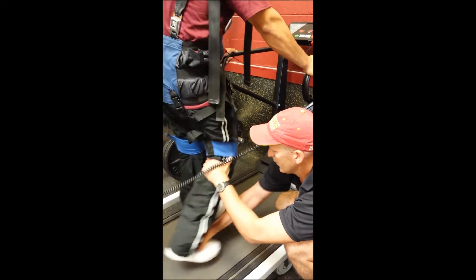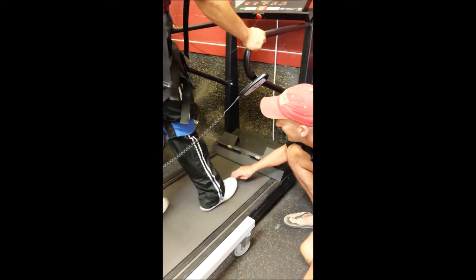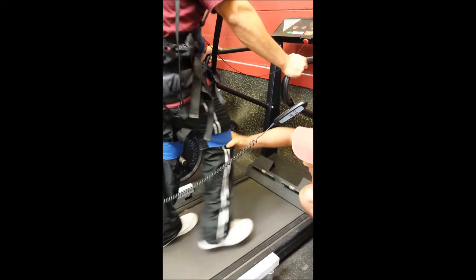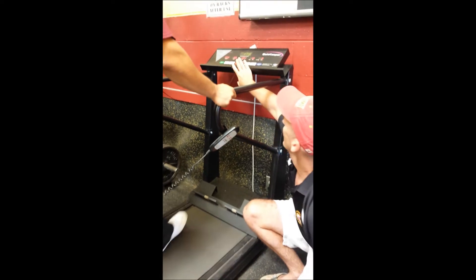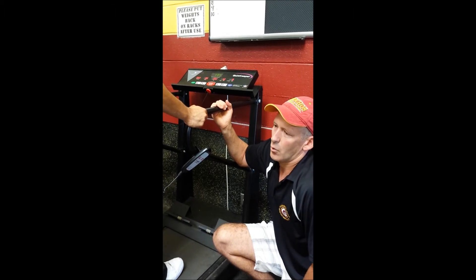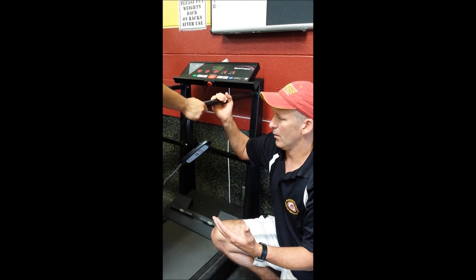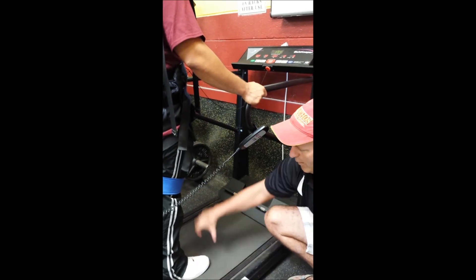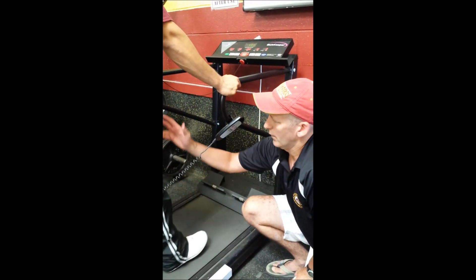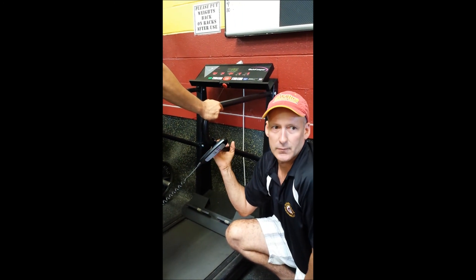I can also cue Tim: 'Step up here — try to hit here, bring that knee up as you come forward.' The beauty of this is that Tim is in a relatively safe environment and I don't need a whole host of therapist aides helping me around a set of parallel bars. I can work on foot drop, placement of a foot that lacks proprioception, hip flexion and driving the knee forward, and the pelvic rotation that's needed — so it gives me a bunch of different options.